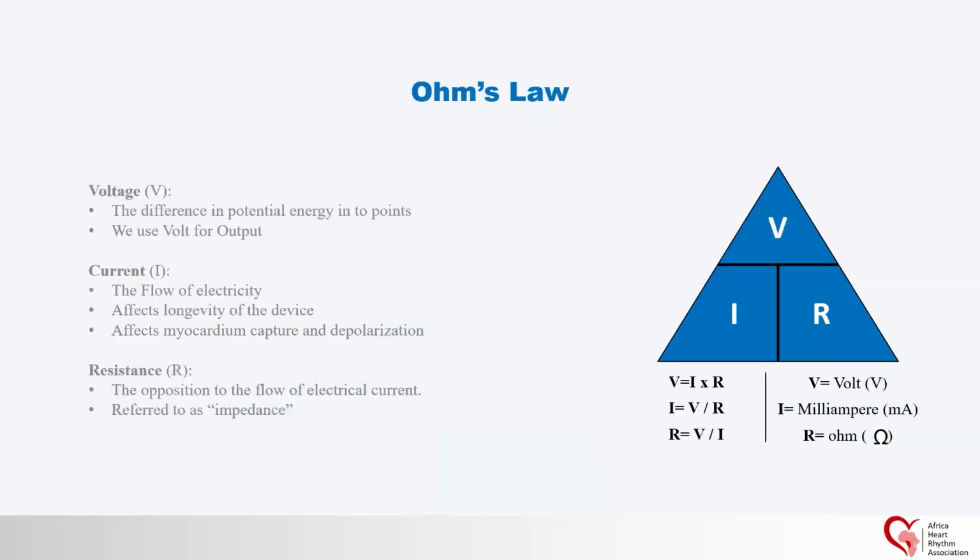So the basic is Ohm's law. In batteries in general, we have the voltage, the current, and the resistance. This is physics. We have the voltage in the circuit, the current that the battery delivers, and the resistance, or we talk about the impedance of leads.